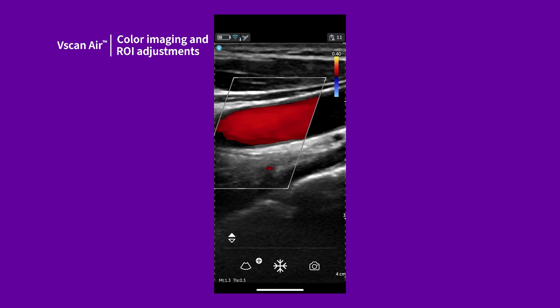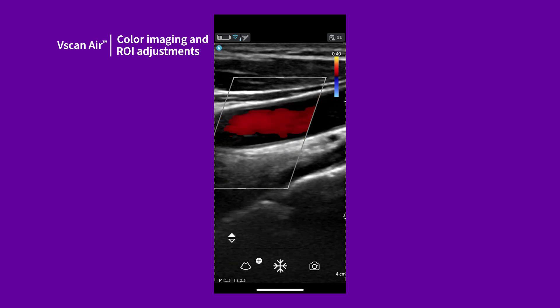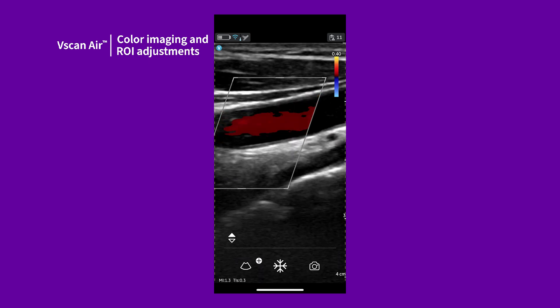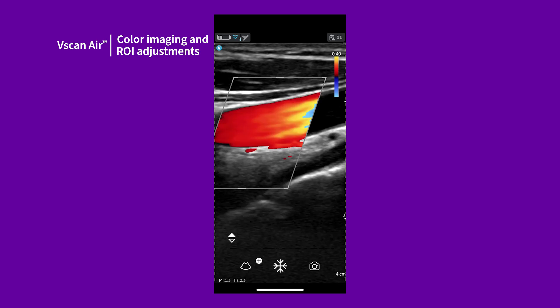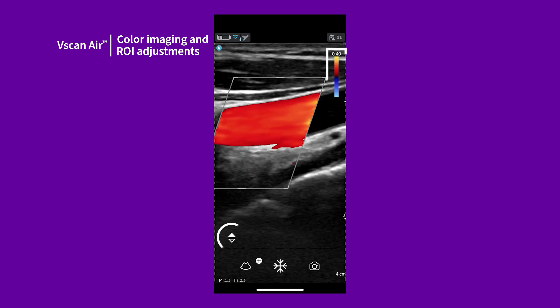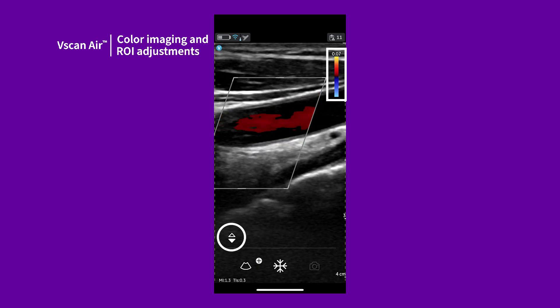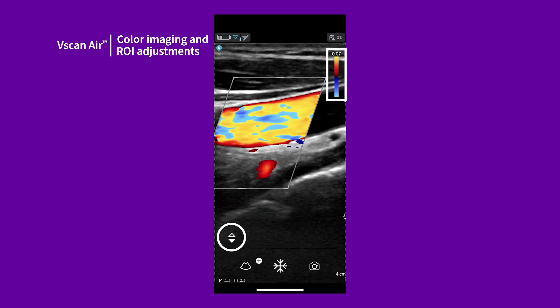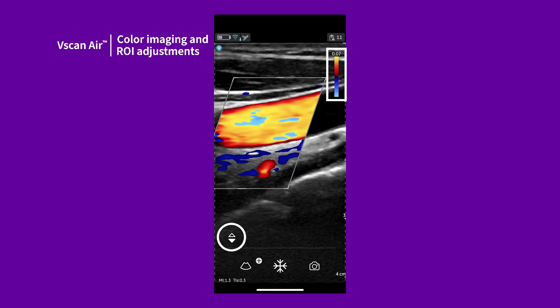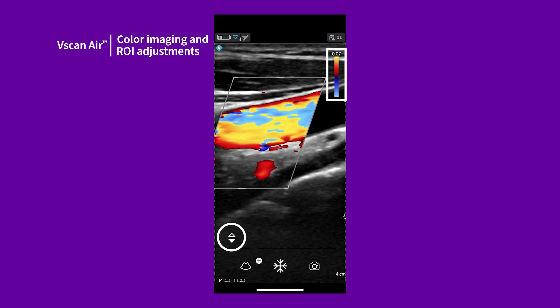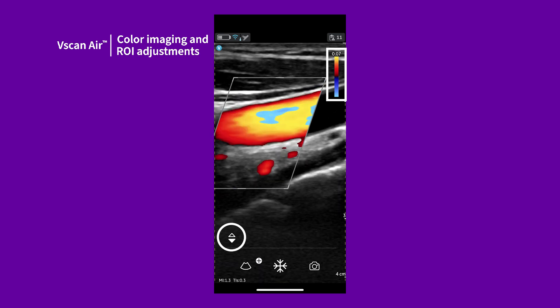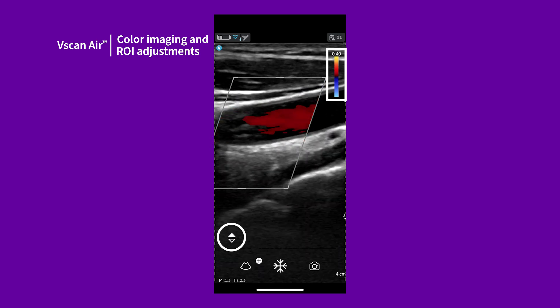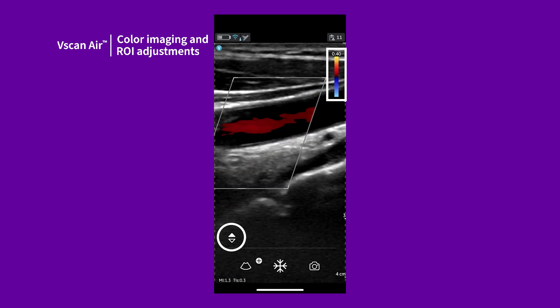On certain presets, there is a high velocity fast flow and low velocity slow flow setting. This is the same control as the resolution penetration button, and is useful for changing the velocity scale to optimize imaging for fast or slow flow.